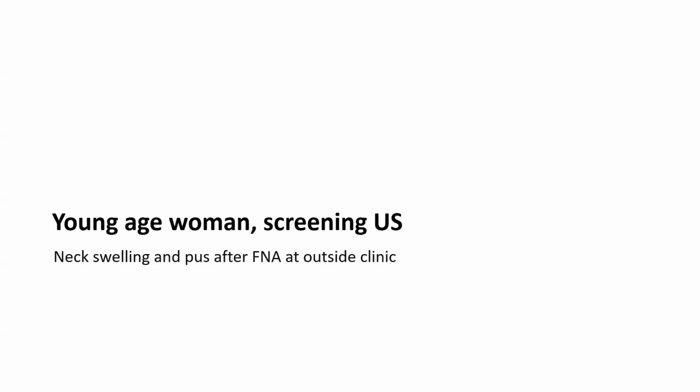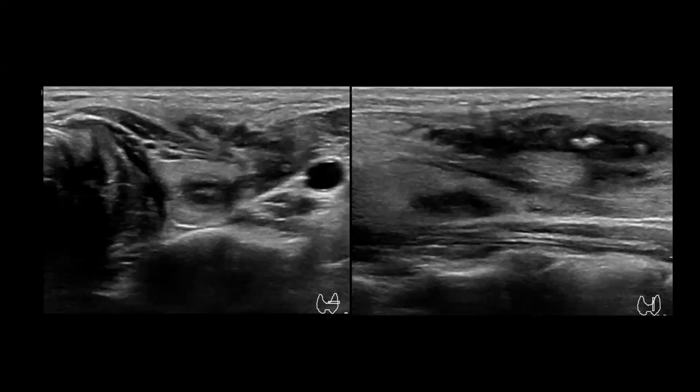The next case is a young woman. After the thyroid nodule FNA, she visited the emergency room with neck swelling, pus on the area where she was stabbed with a needle, and worsening pain. A hypoechoic lesion is visible inside the thyroid gland and is connected to this lesion, spreading inflammation to surrounding tissues, including muscles.